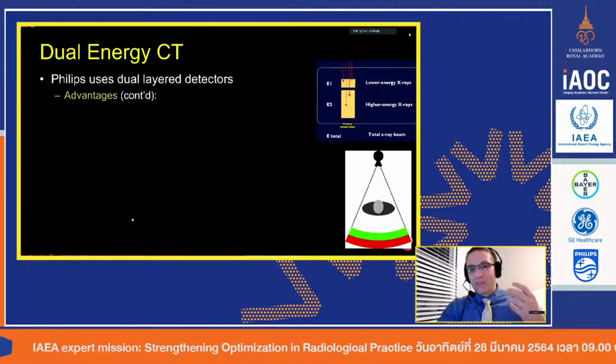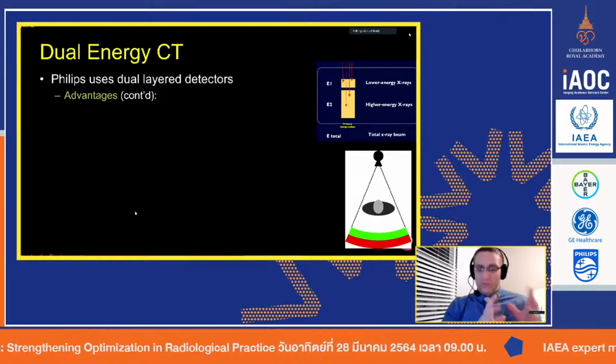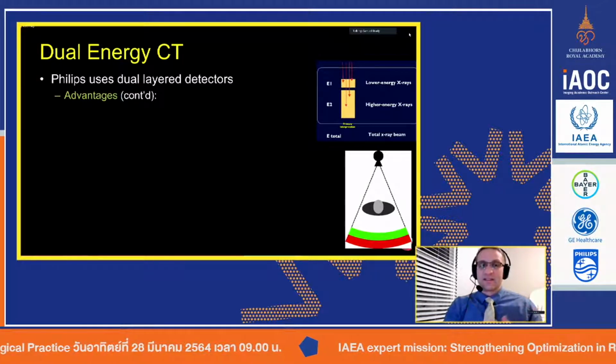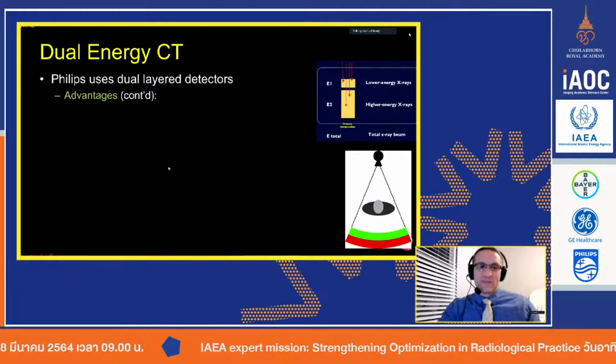So what that study demonstrated was that radiologists would actually prefer to have more information coming from dual energy consistently, instead of the way we do it now, which is that we simply protocol it based on patient history.